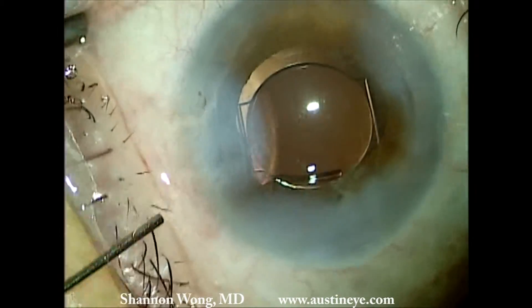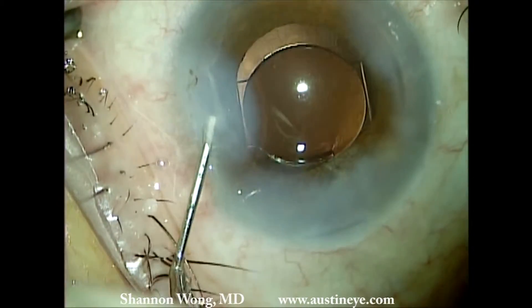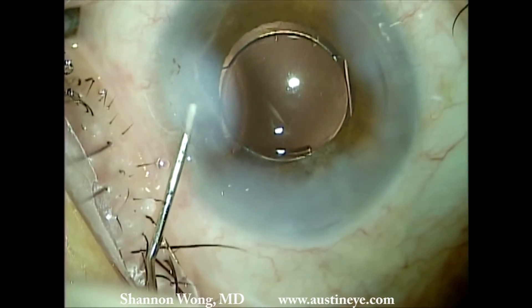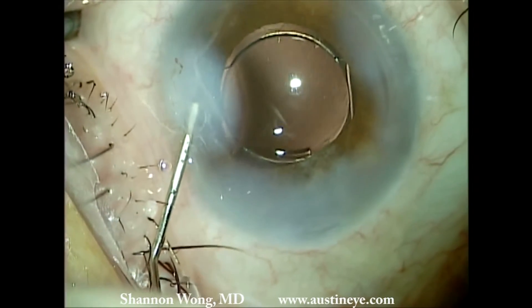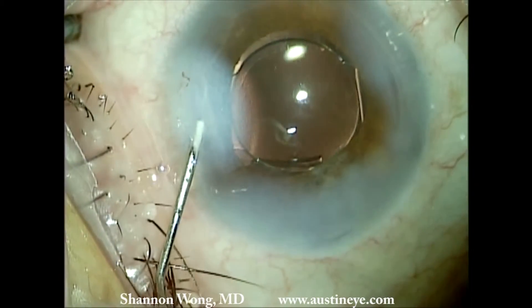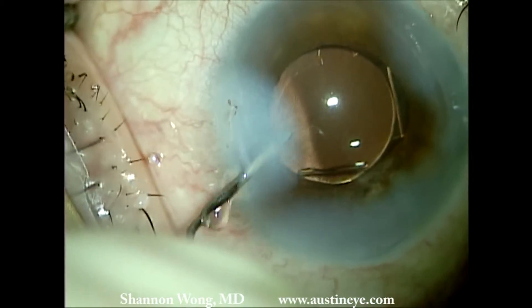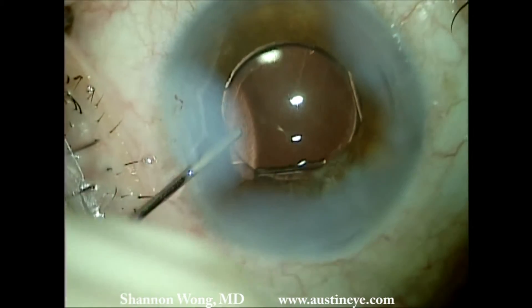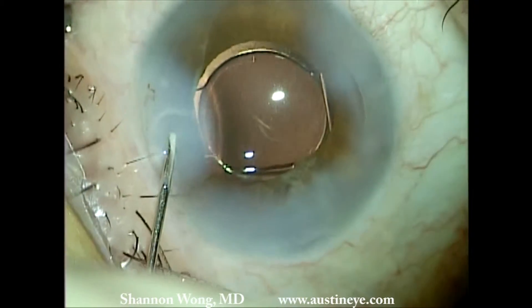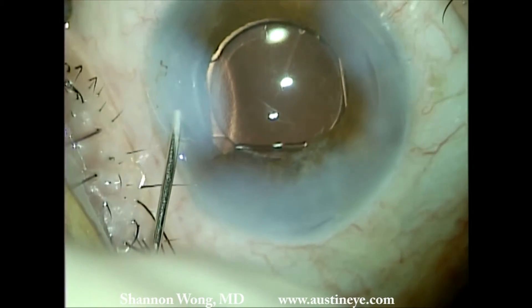We then make sure that the lens is vaulted posteriorly. As we re-inflate the eye, we see that the right-sided haptic positions itself nicely. It moves posteriorly and we have eliminated this patient's Z syndrome.